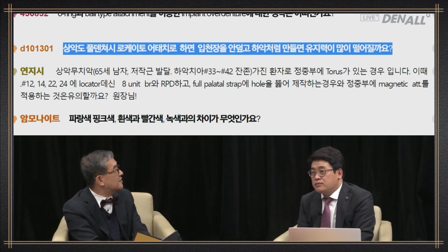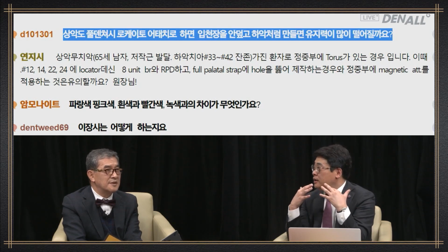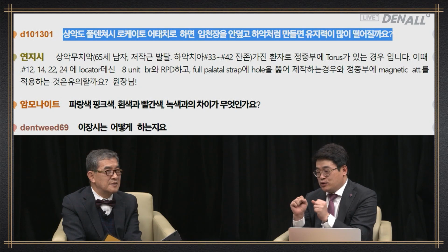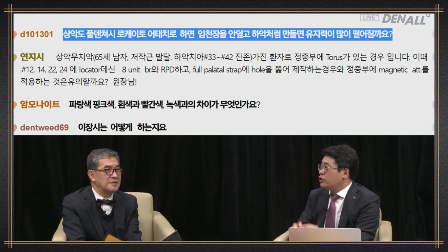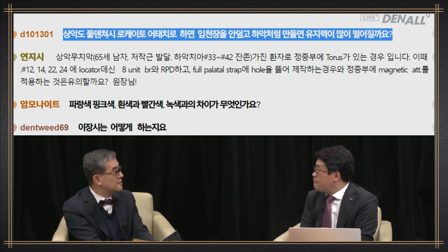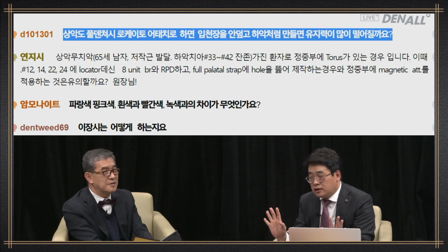When I learned, the bone quality of the upper is weak, and when we place the implant, because of the bone resorption pattern, labioversion occurs. If I place 4 single implants here, and if the occlusal force is 100, the force is not distributed by 25 each and is concentrated on the weakest one, leading to implant failure. Therefore, in the upper, I prefer to use the bar type which connects all 4. That's how I learned. Then, in order to effectively disperse the occlusal force, we need to cover the palate.